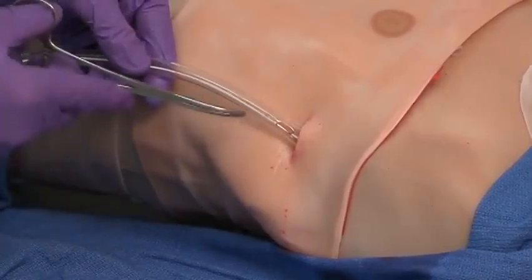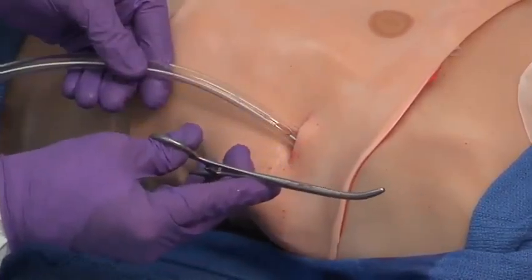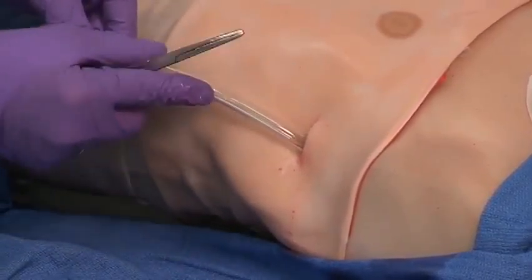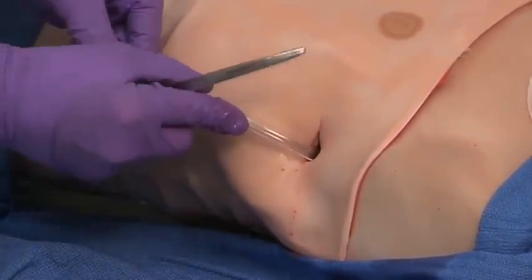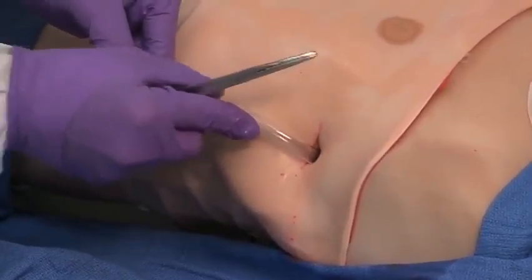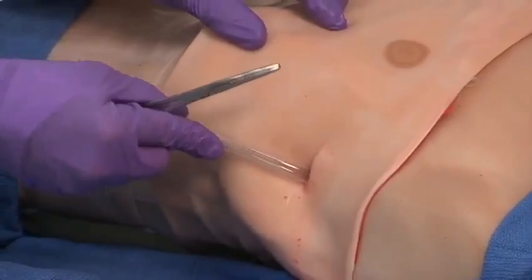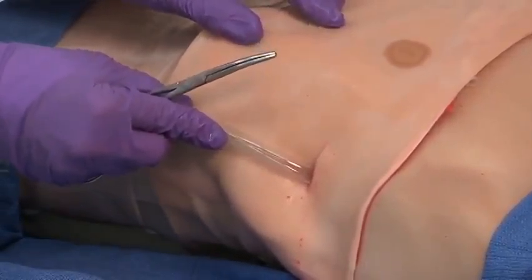My goal now is to have this go in a posterior direction, laying along the back of the chest wall towards the apex. So that last hole's going into the chest, I'm advancing it, and I usually advance this till I feel a little bit of resistance. That tells me I'm bouncing off the apex, and then I pull back a slight amount, so this is 1 or 2 centimeters from the apex.